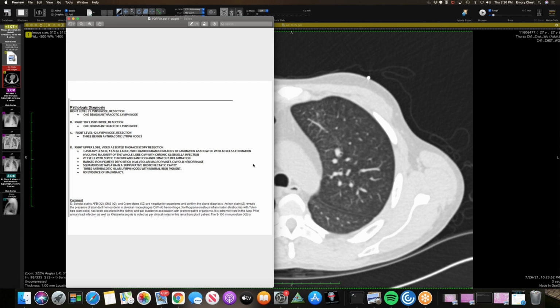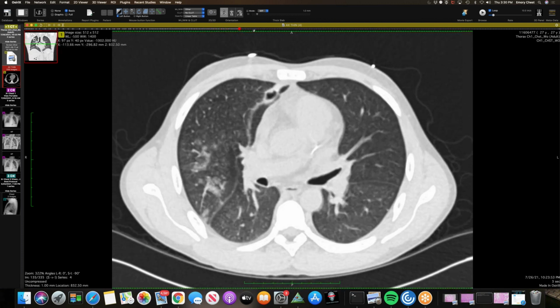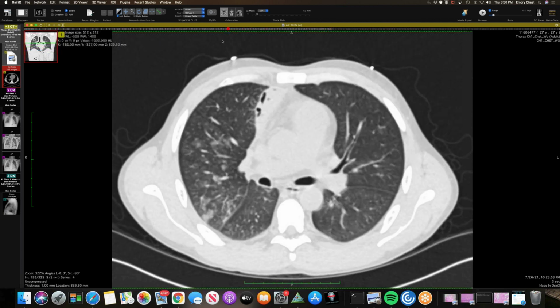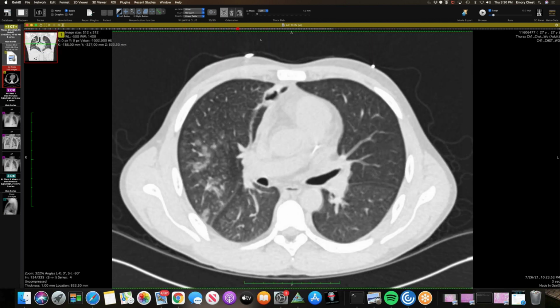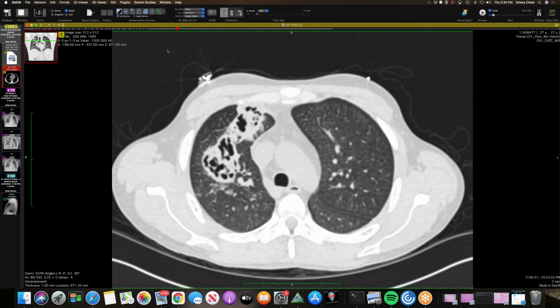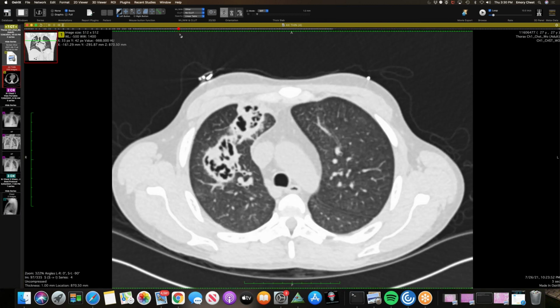But yeah, I can send this. And then as far as all the tree-in-bud, maybe it's just the same process, just a bronchogenic spread, perhaps. Yeah, the granulomatous inflammation. It looks very walled off. It's kind of interesting. The cavity looks very walled off. So it doesn't seem like a super aggressive, angioinvasive process. It looks walled off. I agree.